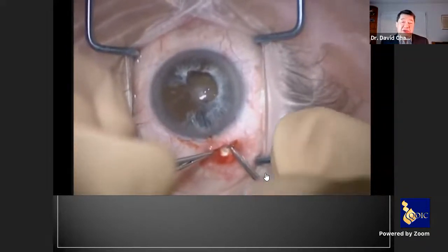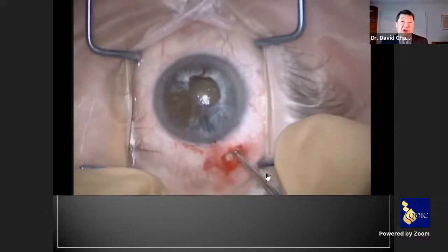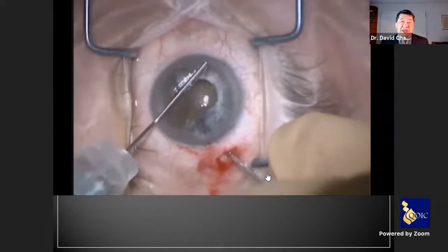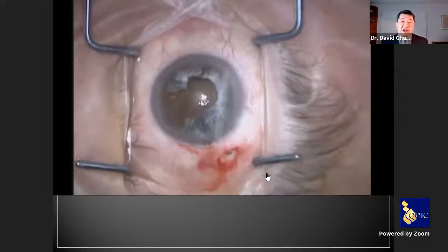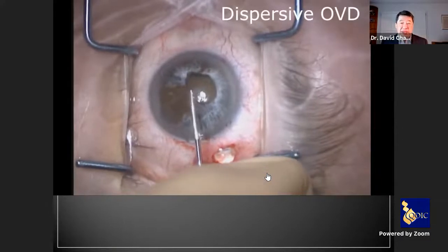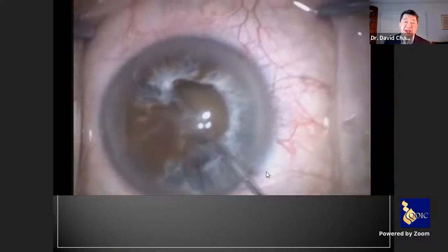It's basically a small gauge vitrector, and I just take out a little bit of vitreous. Now, I don't want to make the eye too soft, so I palpate the eye, and when it's starting to just get a little soft, I can stop. Now fill the anterior chamber. Now I can see the lens and the iris go backward and I have normal depth.